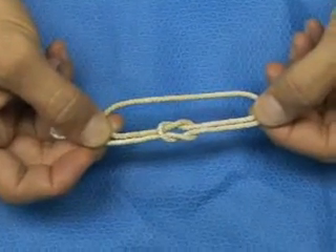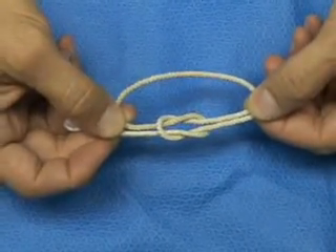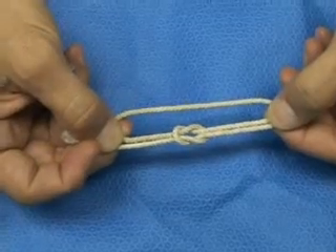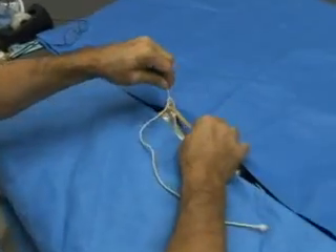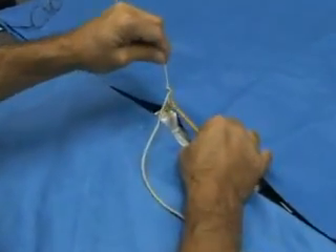We call them square knots in the operating room. Officially, what I will show you and call a square knot is officially known as a reef knot, not a square knot. But in the operating room and among surgeons, you're going to hear this described as a square knot. The advantage of the square knot is it has very good breaking strength, and most importantly, this knot will not slip once properly tied.